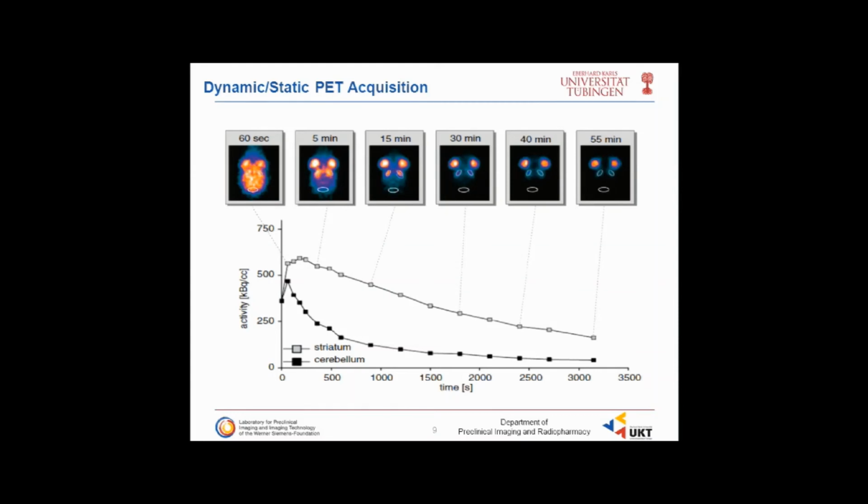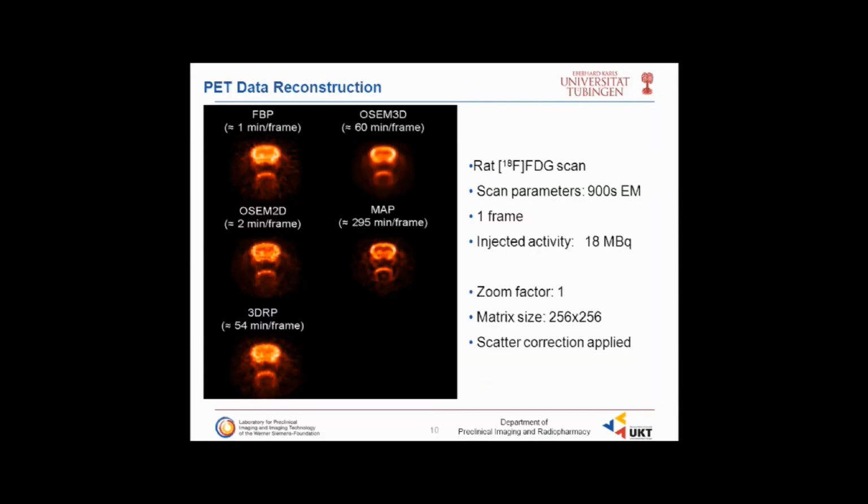And actually, if these small frames are very noisy because you have low count rate statistics, you get really in trouble to get good quality of data, good image frames. And you have also a huge problem if you want to do pharmacokinetic modeling with very noisy data. So therefore, I would like to make again the point, I think the sensitivity of the PET scanner is one of the most important factors if you buy a PET scanner, especially if you want to do receptor studies, as I show you later.